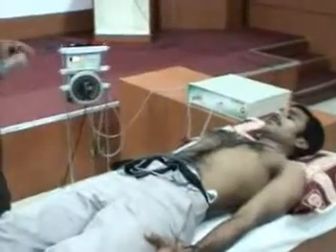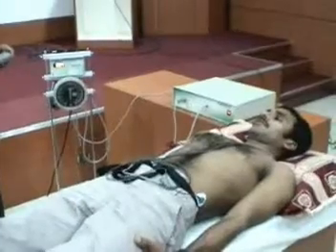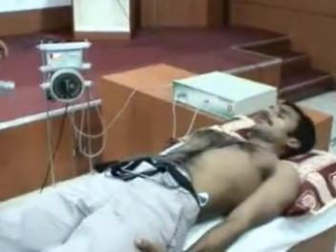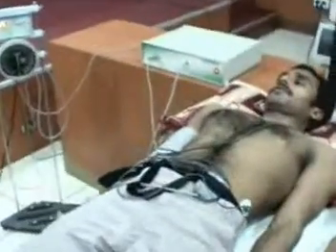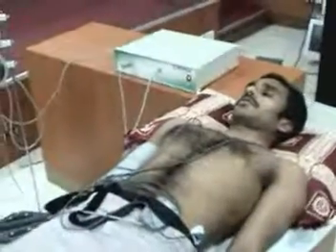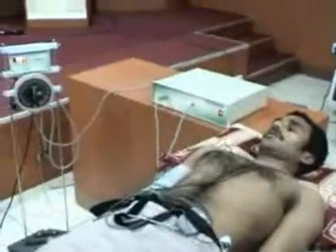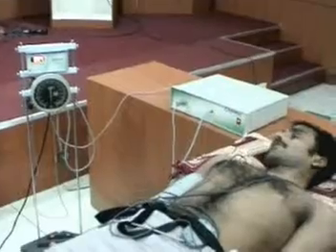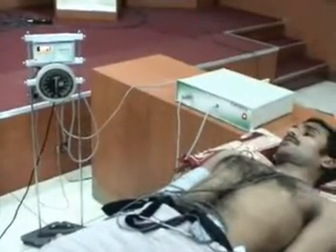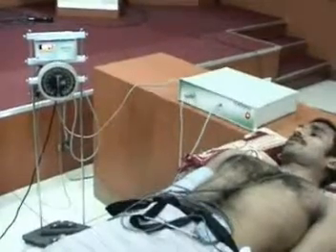So now we have two more tests to do, and we have attached a BP cuff to your right arm, which will inflate and deflate automatically. So there will be some tightening of your arm. Now we'll be testing. The first will be the blood pressure response to standing. When the green light is on, you have to lie down, and when the red light is on, you have to stand up. Then a BP is automatically recorded.